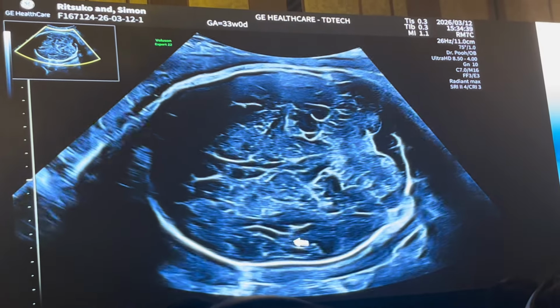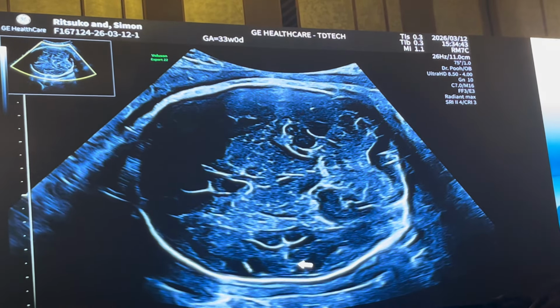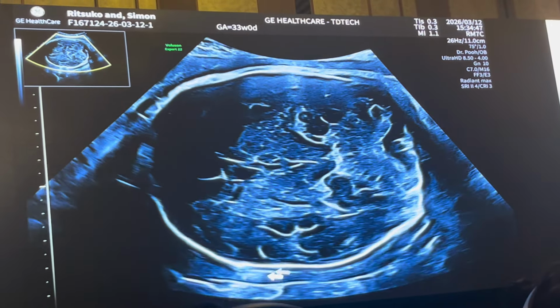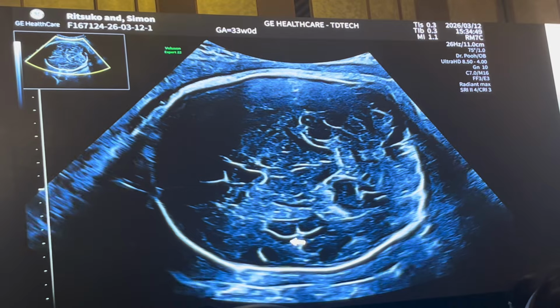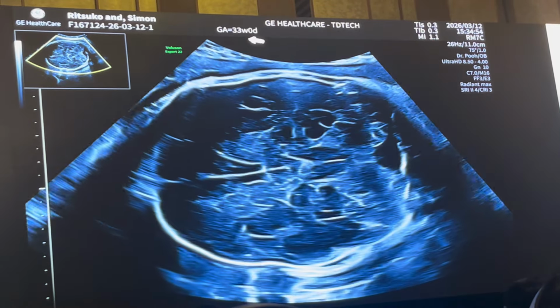I check to see that the Sylvian fissure has operculization at 33 weeks. So we can see posteriorly there's operculization and anteriorly there's operculization. So it comes up to this point and goes out and out. And this is exactly what I expect for 33 weeks.